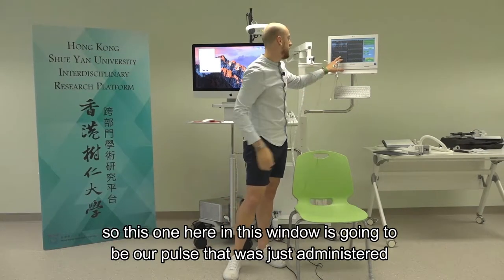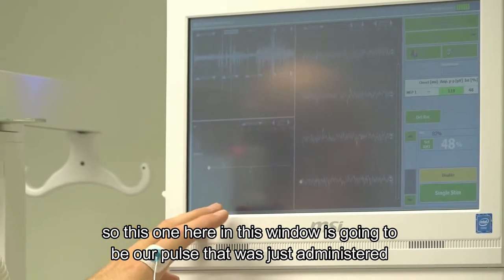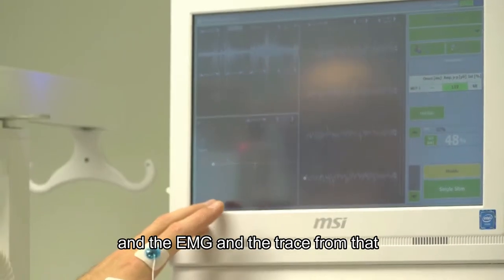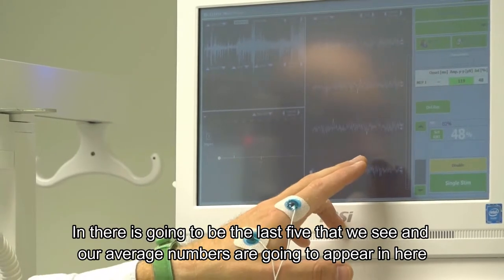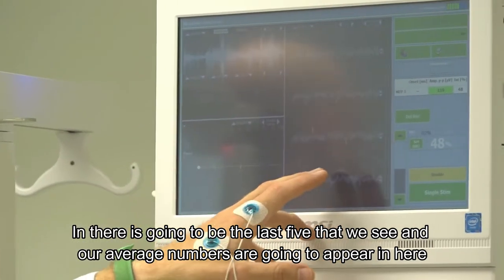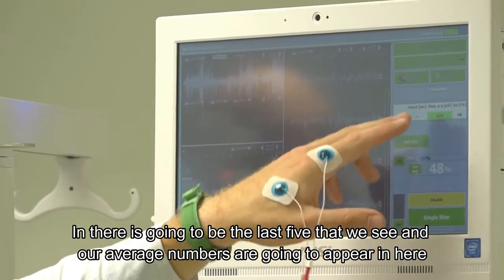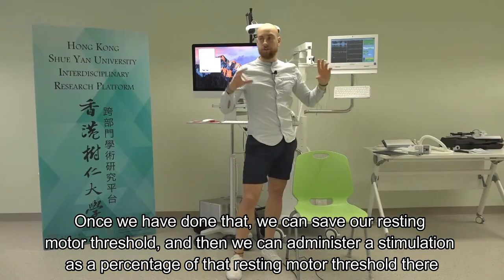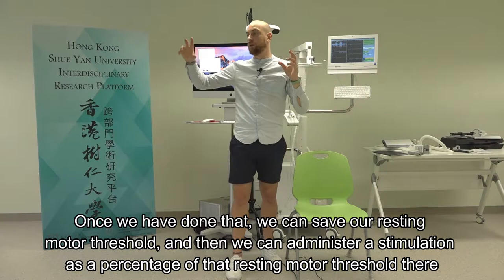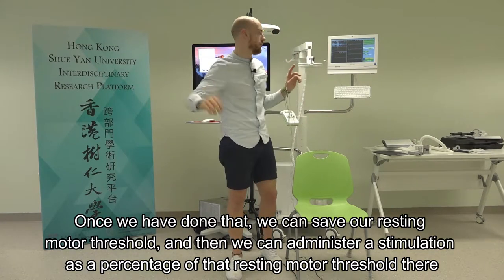This window shows the pulse just administered and the EMG trace from it. The other window shows the last five traces we've seen, and our average numbers appear in a third window. Once done, we can save that as our resting motor threshold, and then administer stimulation as a percentage of that resting motor threshold.